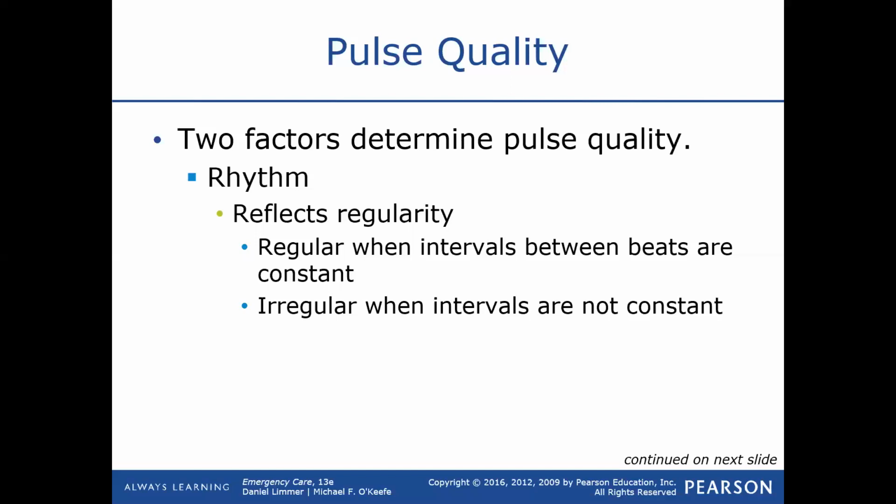That's why it's very important we don't just throw the pulse ox on the patient and write the number down. Okay, as I said in the last section, they are tools. They're great tools, but we always have to take a manual pulse as well. So if you put that pulse ox on their finger, great. Also feel their pulse. You're checking the machine to make sure that it's reflecting the right number. And 2, you're checking to see if that pulse is regular or irregular.